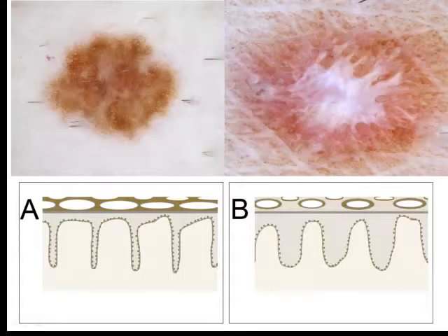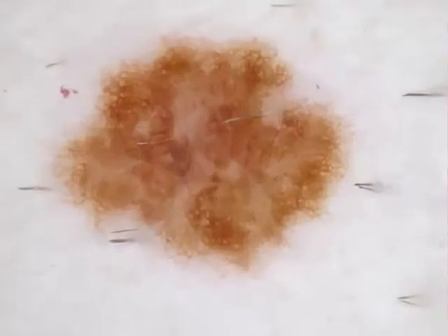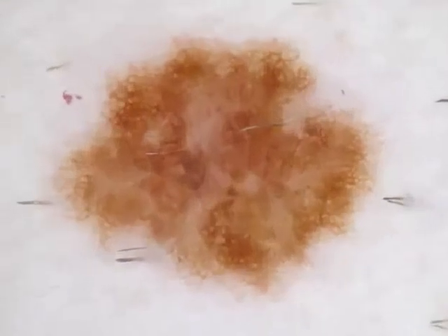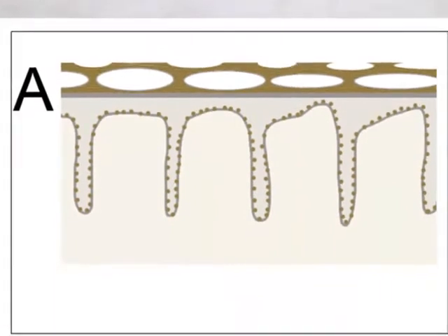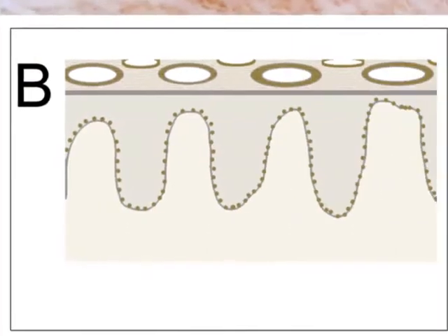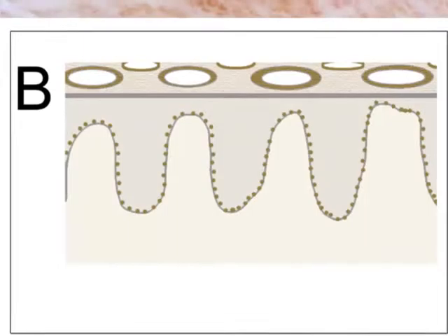Here on the left side, you see the dermatoscopic image of a junctional nevus. You don't see circles, but you see a reticular pattern. The reticular pattern comes into being because of hyperpigmentation of basal keratinocytes, and you see a reticular pattern because the rete ridges are narrow and dermal papillae are broad. If the dermal papillae are narrow and the rete ridges are broad, which happens in acanthosis of the epidermis, like here on the right side, you see non-facial skin circles, like in this dermatofibroma.